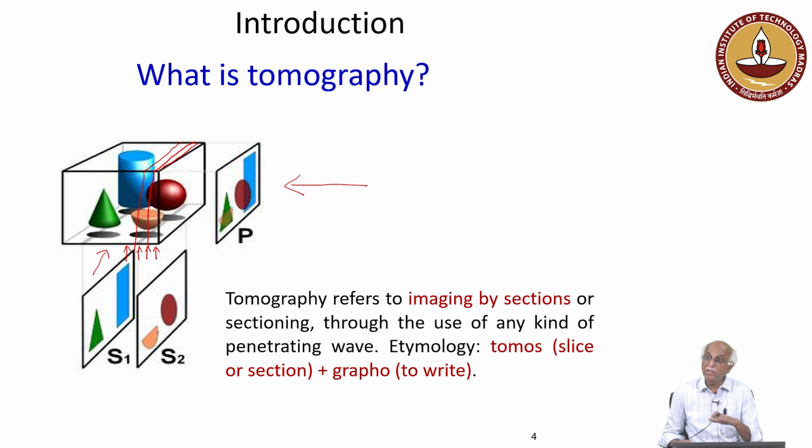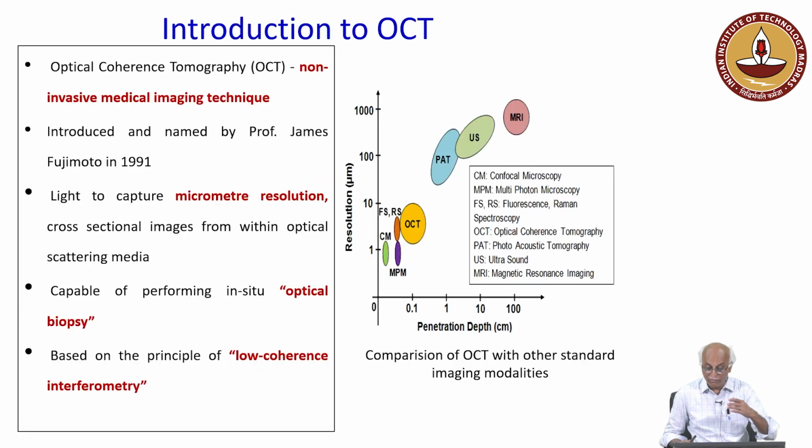But if you are using a permissible limit, which is quite higher than the X-ray limit, we will be able to access information related to the tissues, specimens, and samples beneath the surface. That allows optical techniques to be used in a safe manner, and that is why there is interest in optical tomography. Of course, there are various modalities which can also allow such tomographic sections.